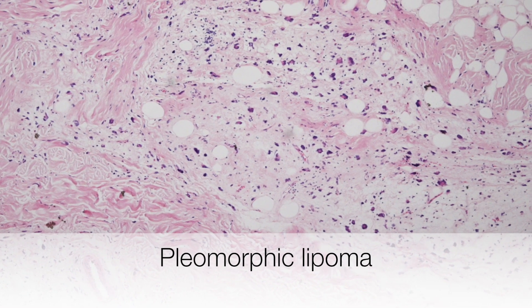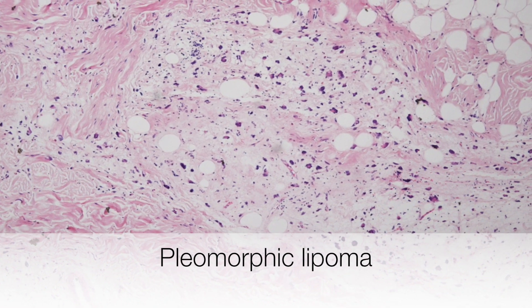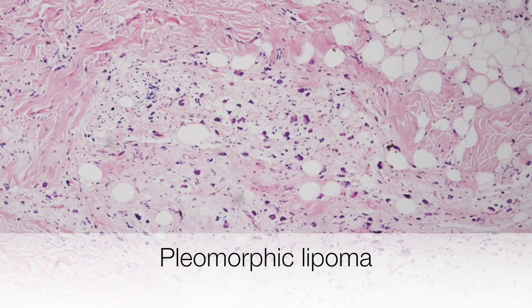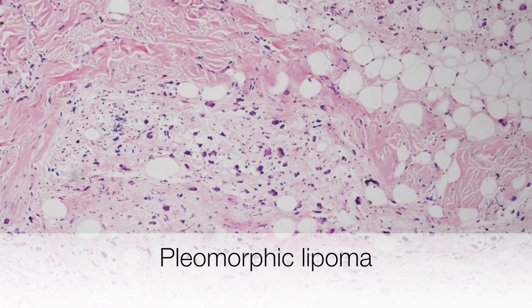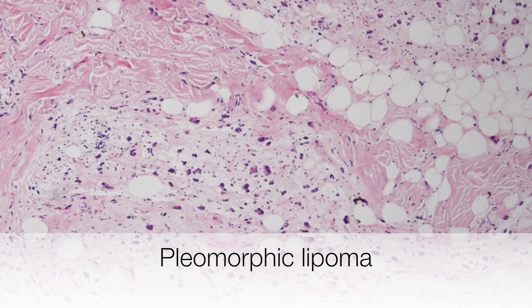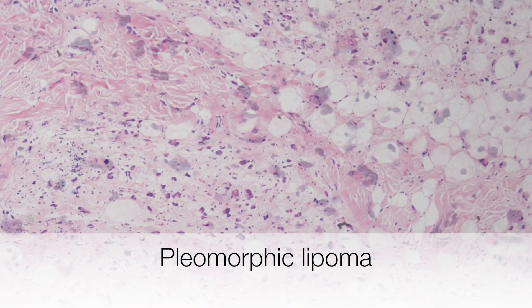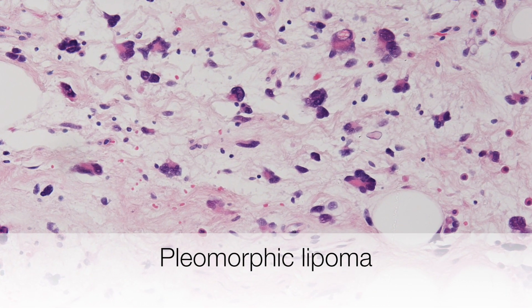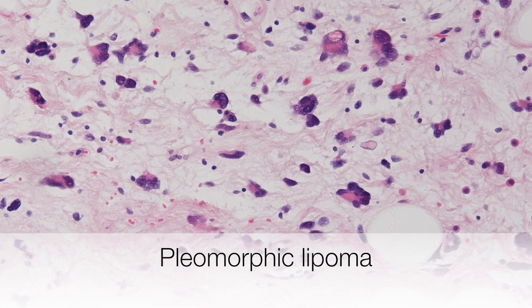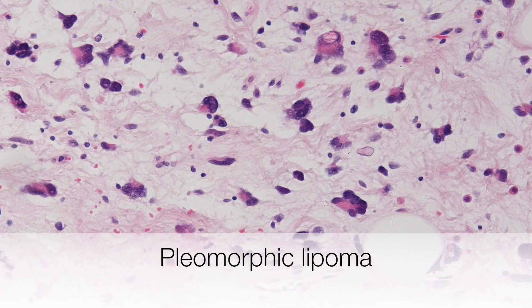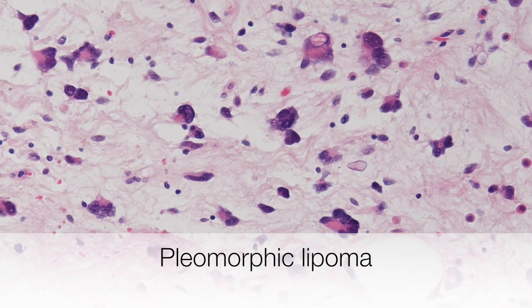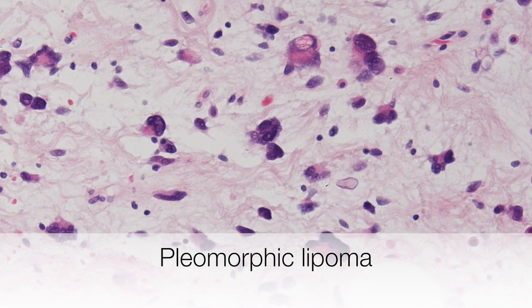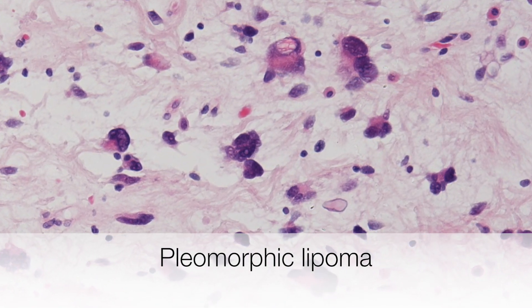This is a nice example of a pleomorphic lipoma and it is composed of adipocytes with nuclei of varying size and shape, some arranged in florets forming giant cells. So this is a good example of cellular and nuclear pleomorphism in a benign tumour.